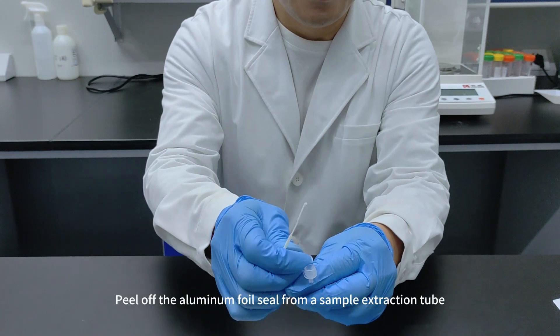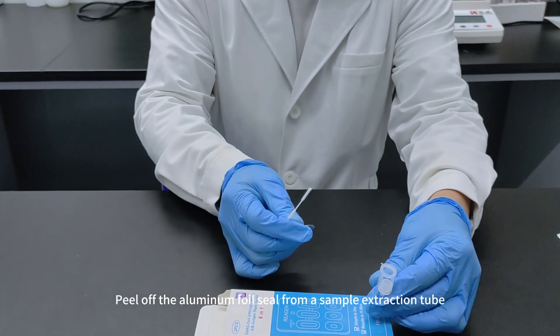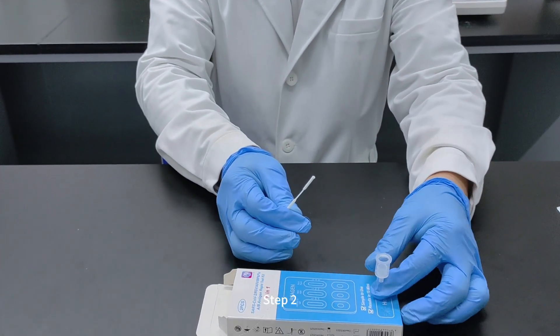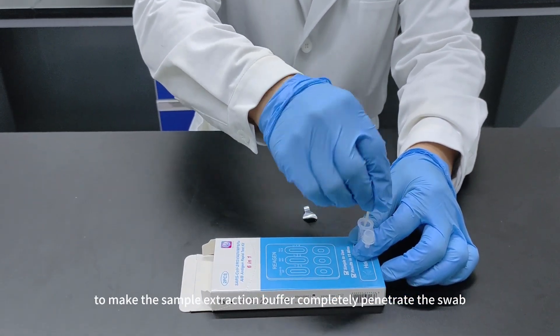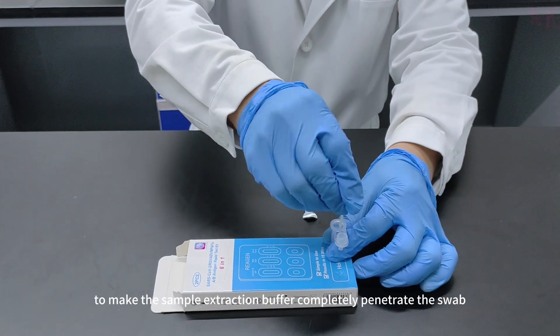Step 1: Peel off the aluminum foil seal from a sample extraction tube. Step 2: Immerse the sampled swab into the sample extraction tube to make the sample extraction buffer completely penetrate the swab.